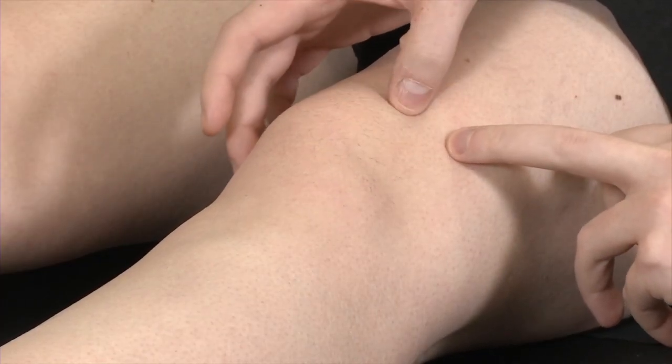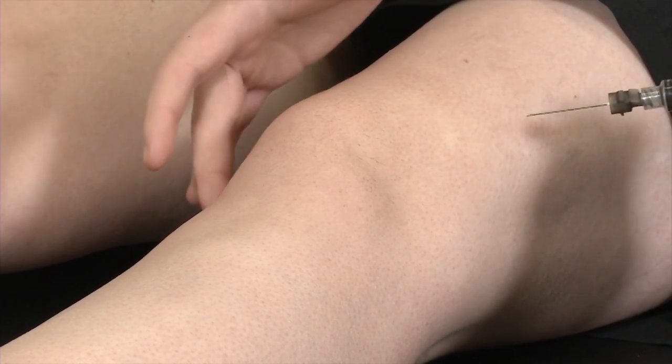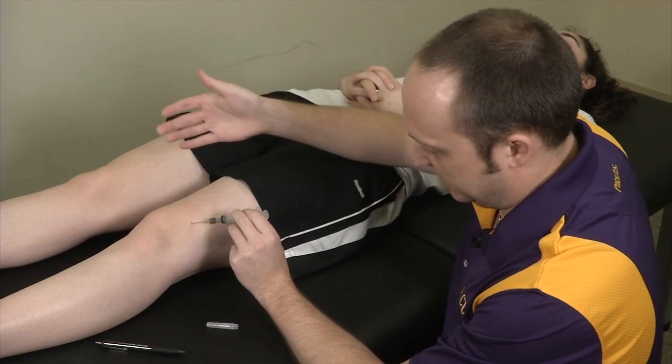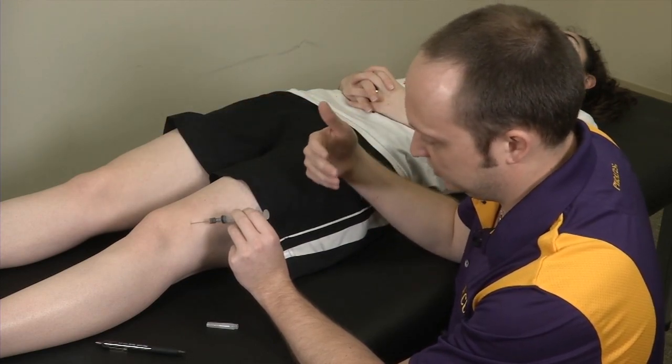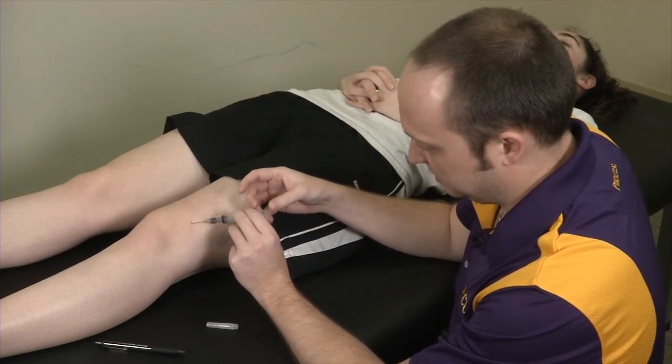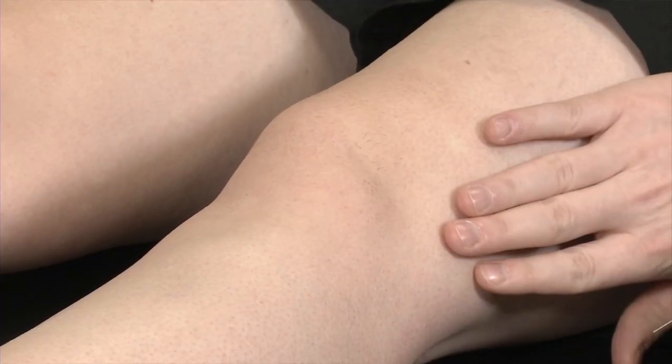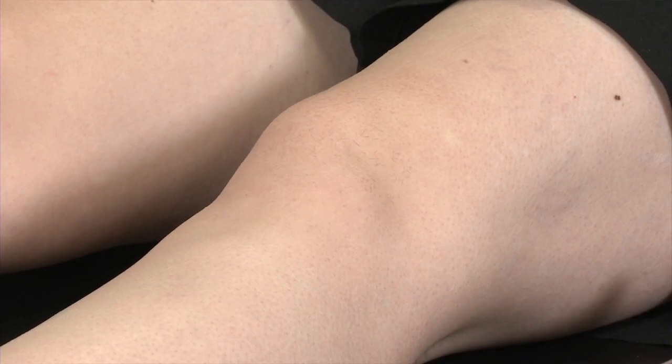So again, two finger breadths superior, two finger breadths lateral, aiming towards the medial femoral condyle, the needle enters. Whether this is an aspiration or injection, you're going to withdraw to aspirate fluid or plunge the needle to inject your injectate, and then withdraw your needle, clean the area, and apply your sterile bandage. And that's your superior lateral approach for knee injection.